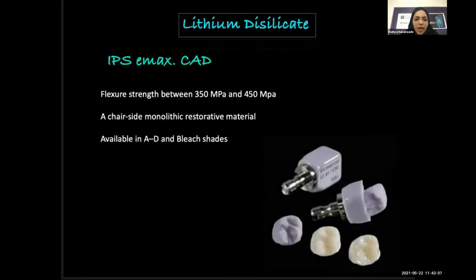Let's go with the lithium disilicate family. Lithium disilicate glasses have their flexural strength between 350 to 450 megapascal, and this is significantly higher than that of leucite reinforced dental ceramics. IPS e.max CAD, a lithium disilicate ceramic, was introduced in 2006 and is a chairside monolithic restorative material.